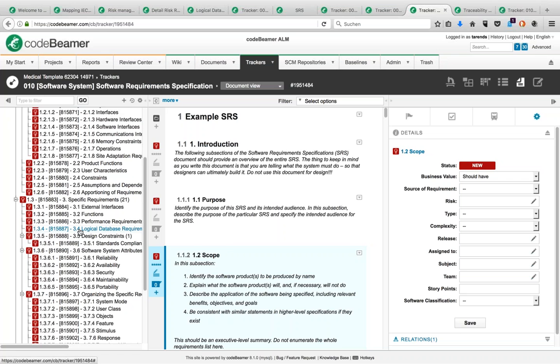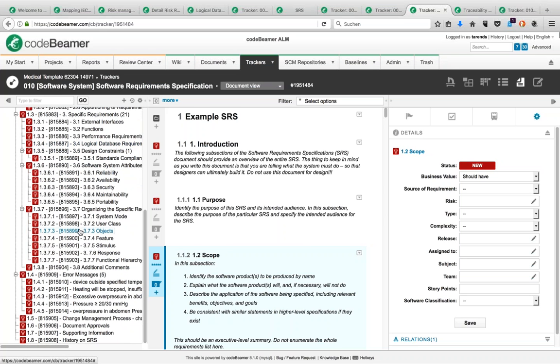That's all in that template. How do you handle them all? What do you use as error messages? And what you can see here as well is the typical software classification that you have to do according to your decisions. And for sure, you can do that a bit more complicated than just assigning here. So if you have specific areas, we'll integrate that one.